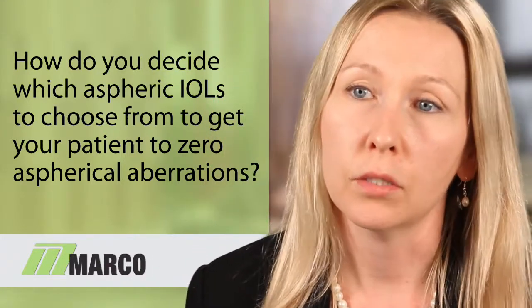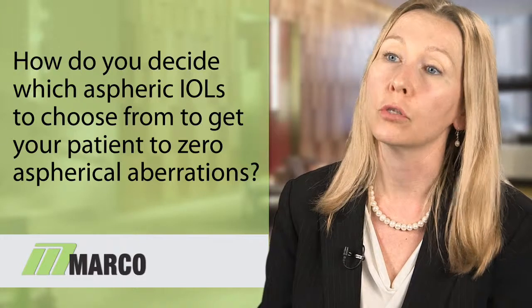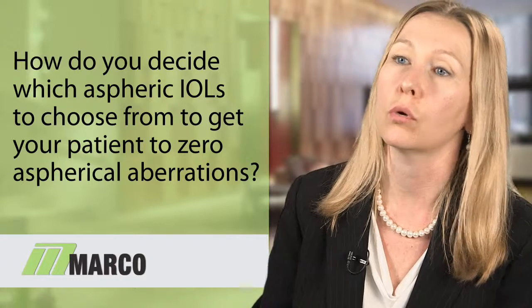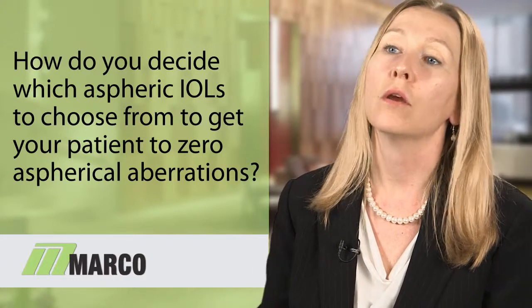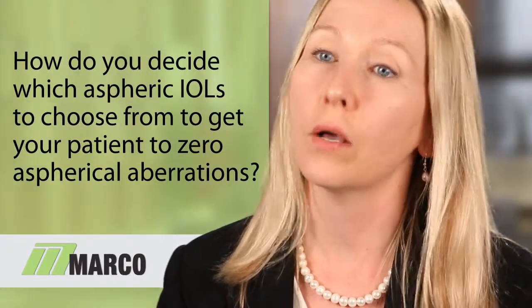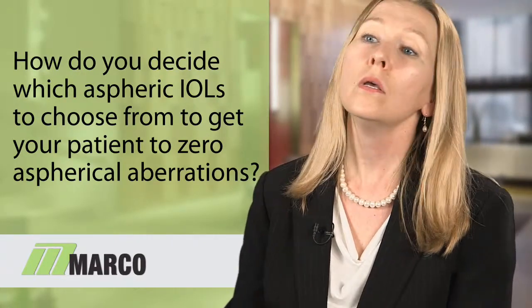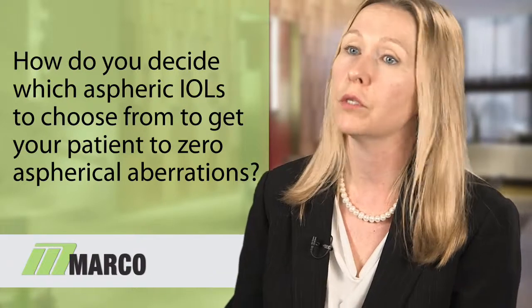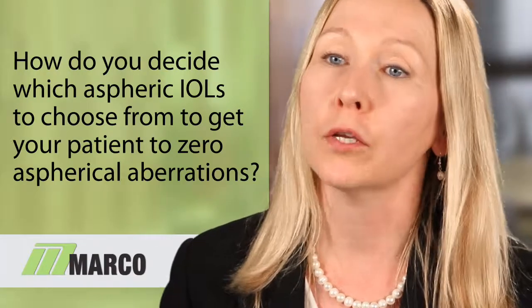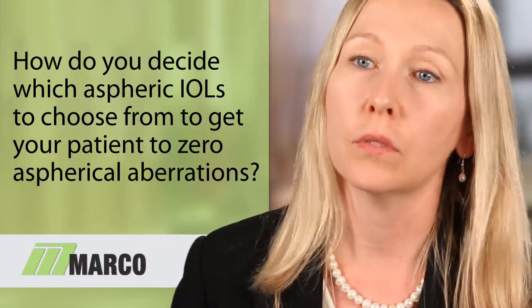They were over -0.6. This patient obviously had high negative spherical aberration before surgery, and then the implant added more negative asphericity to her cornea. And so although negative asphericity is a good thing in most cases, it does contribute to loss of contrast sensitivity, and it did in this patient who was very unhappy. So I was able to come to this patient and tell her what the reason for her problems was, even though she was correctable to 20/20. She was offered IOL exchange, which she declined. However, she was able to understand why she was having the problem that she was having.